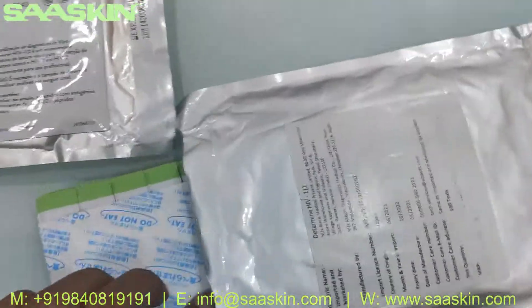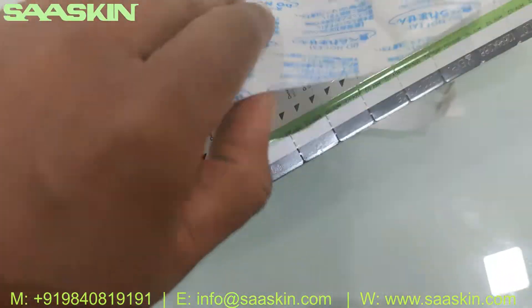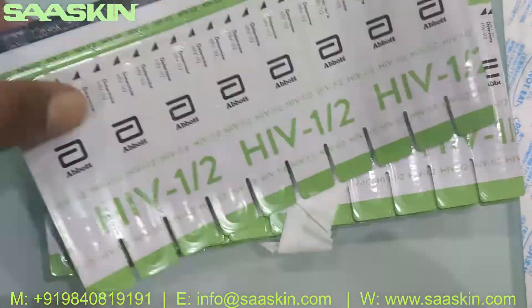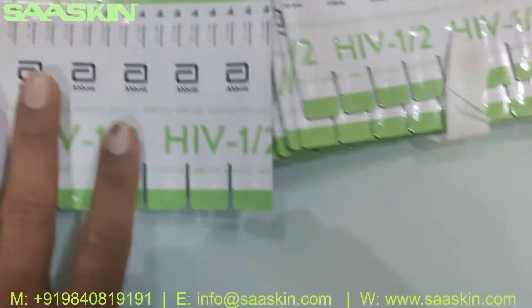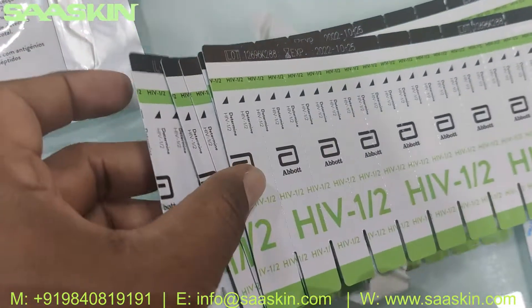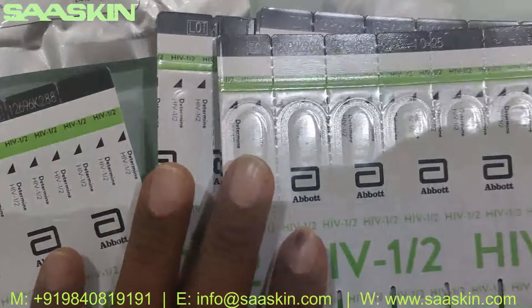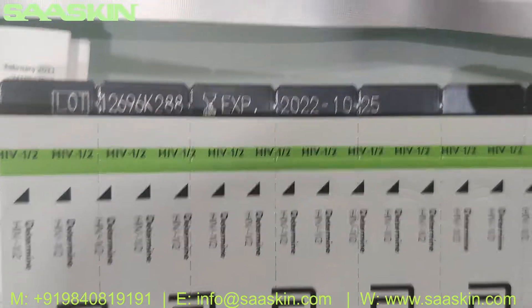Inside the pack you've got the test strips. For temperature maintenance there is a silica pack included. There are 100 test strips in total, with 10 strips in each sub-pack. You can also see the expiry period printed on the strips inside each pack.